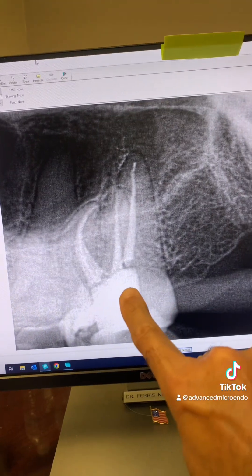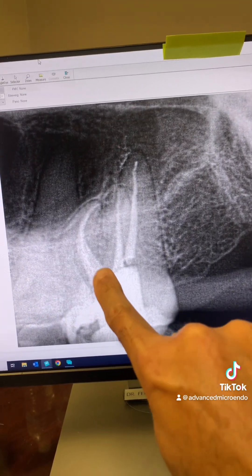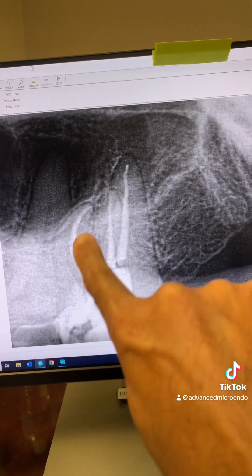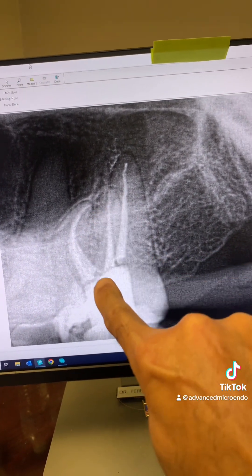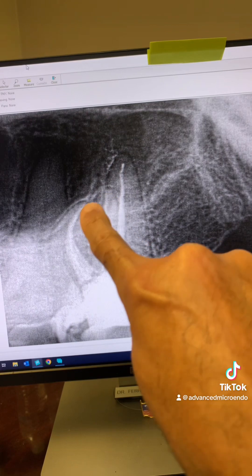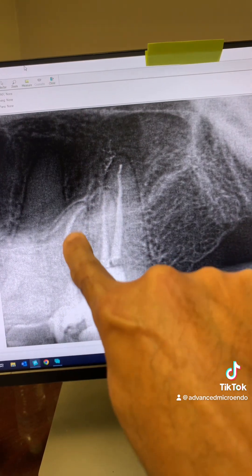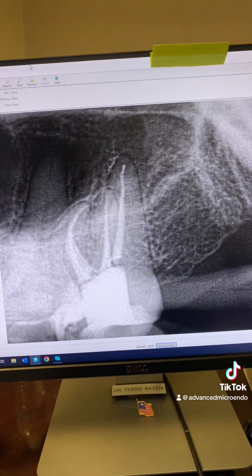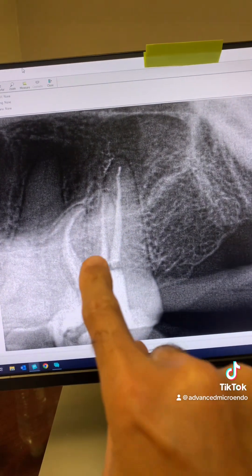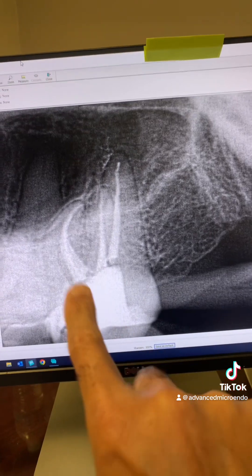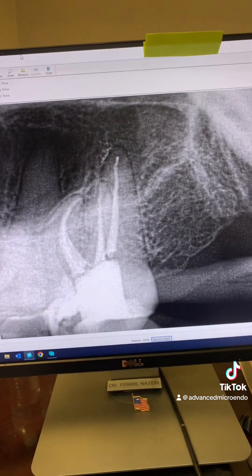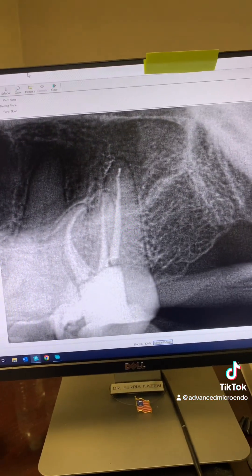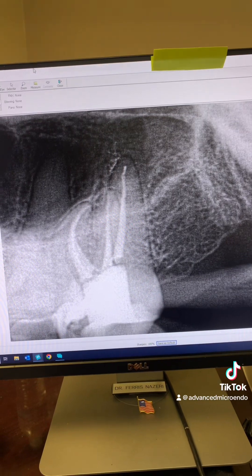Here's another angulation. Now you can see the curvature of the MB root — see that? That's a 90-degree curvature right there. And the MB root had three canals in it: MB1, MB2, MB3.